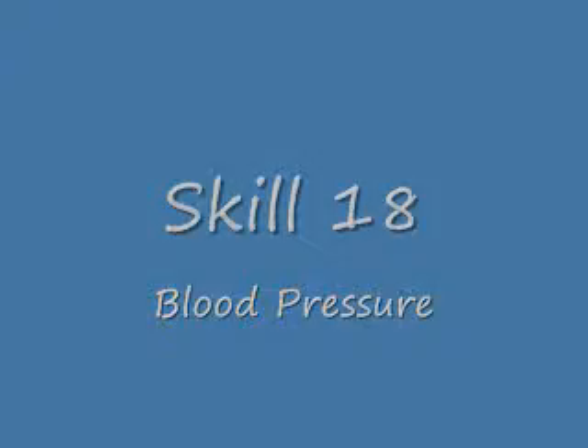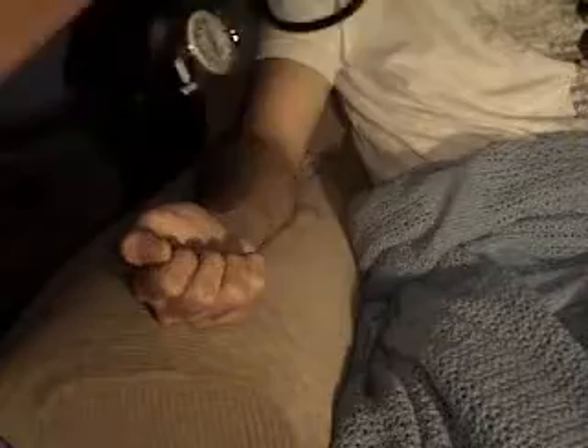Skill 18: Blood Pressure. Knock on the door as usual. Greet the patient and explain what you're going to be doing. You're going to have them sit up for this one — have them sit up and put their arm like so.